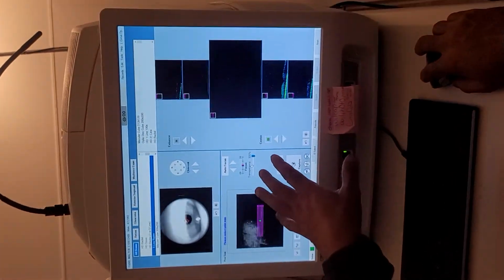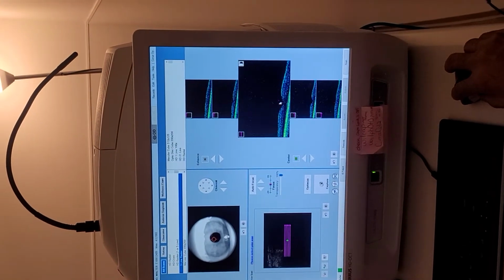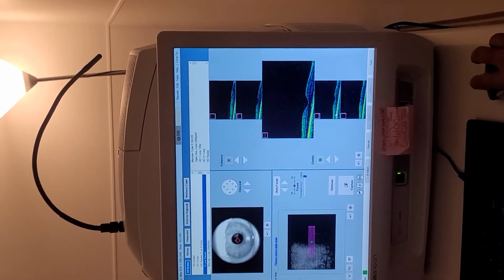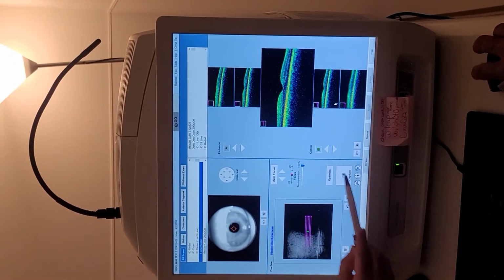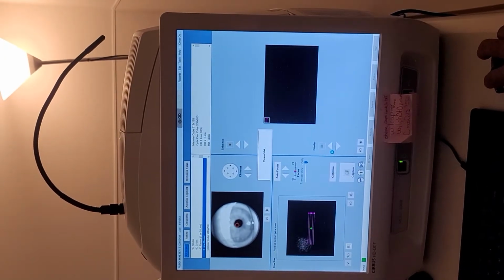Always make sure this is in the center. So you're going to use your wheel to get it. Now you brought it down, so do the opposite. If you totally lose this image, optimize it. Optimizing will bring it back for you.